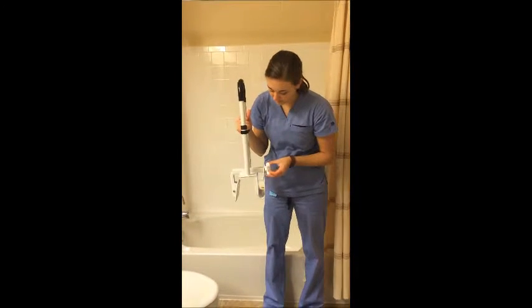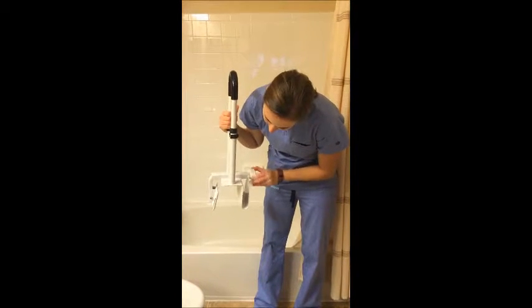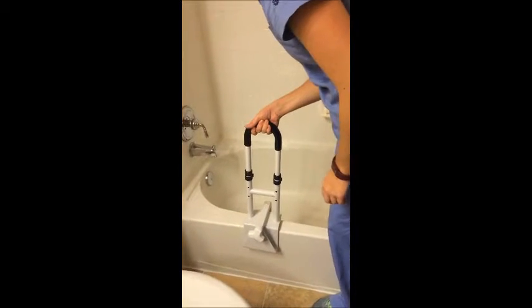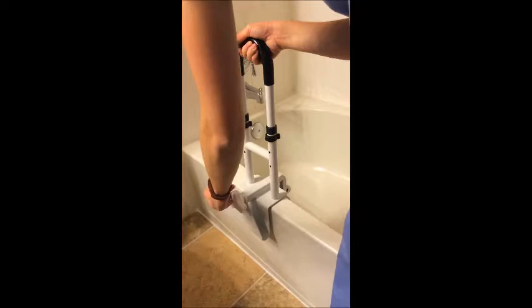To install, first turn the knob on the bathtub safety rail counterclockwise to open the device. Next, place the bathtub safety rail over the side of the tub with the knob facing outward. Turn the knob clockwise to tighten the bathtub safety rail onto the side of the tub.